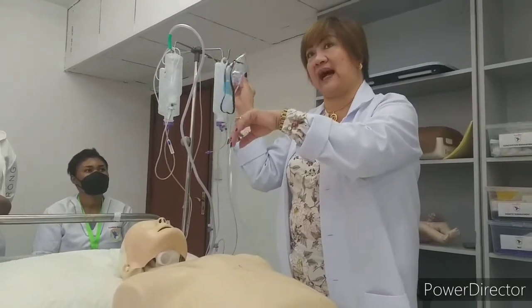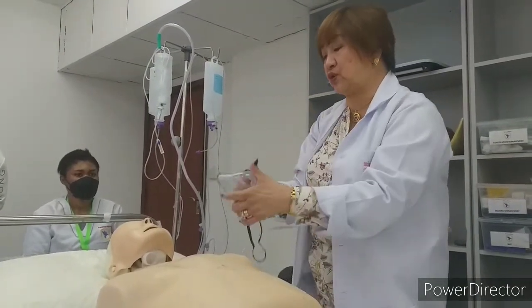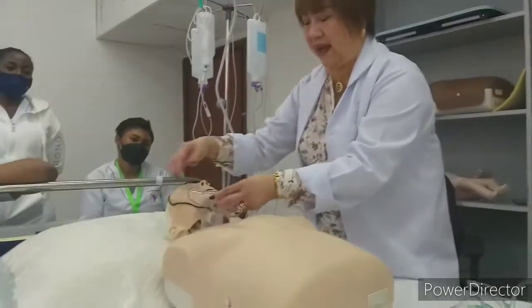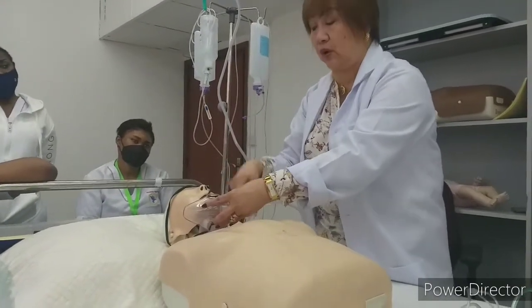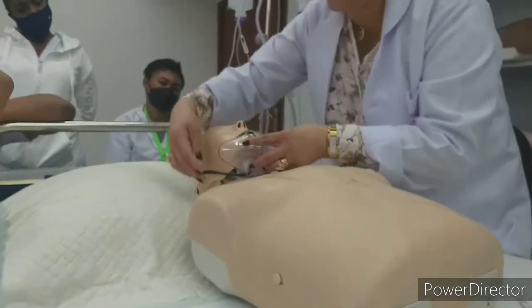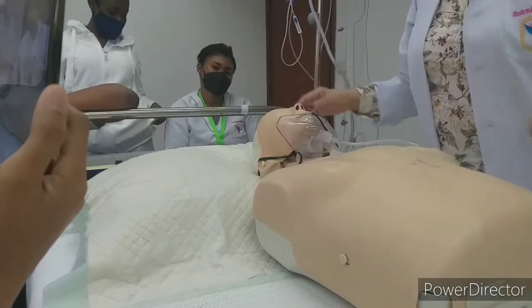Okay, we are giving medical gas. Medical gas, as we said, to provide oxygenation. So, check. Now it's okay. So we will put to the patient. The patient has tracheostomy. Okay, sideways. Put it covering the down of the tube and to the chin. Keep it to the patient's over the ear. Adjust it. Okay, and leave it there.